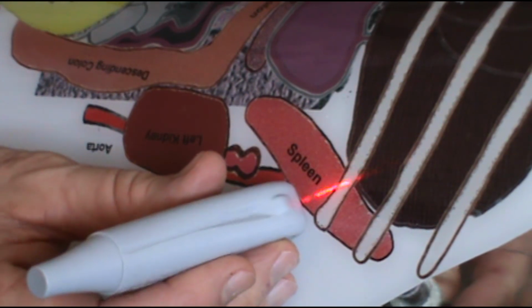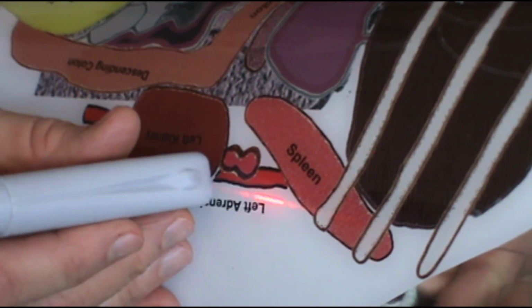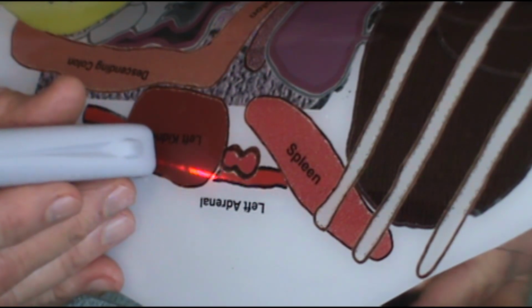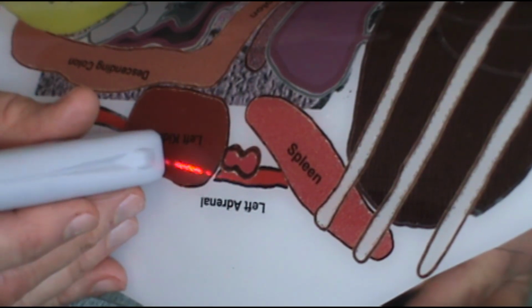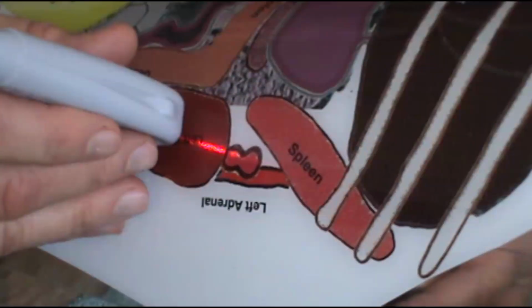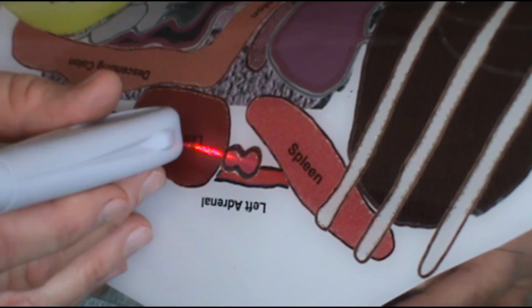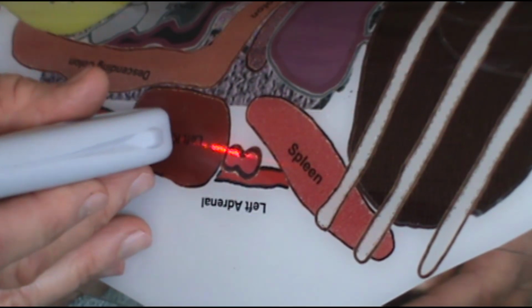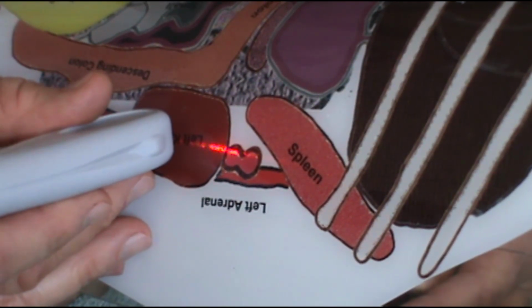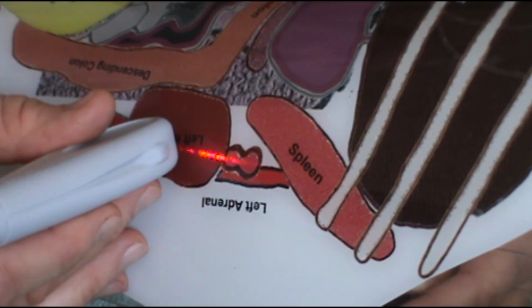Rotate the transducer to a left lateral sagittal position and slide caudally from the last rib to find the left kidney. In a lateral sagittal transducer position, the kidney has a kidney bean shape and can be bisected into two equal halves. To bisect the kidney, the transducer should be perpendicular to the patient's body and parallel to the tabletop or floor. My abdominal graphic does not simulate this position well, so I will compensate to obtain the proper transducer position.